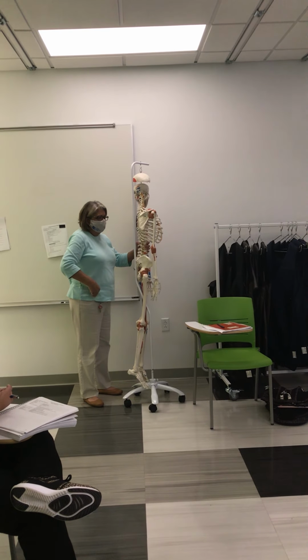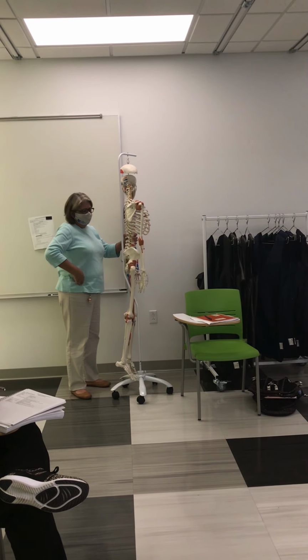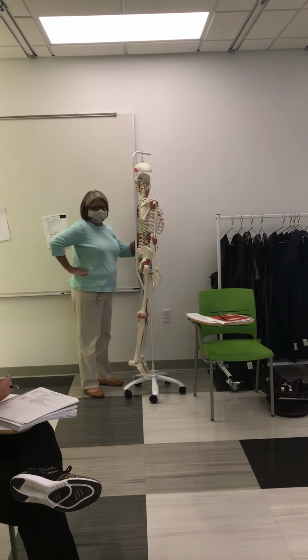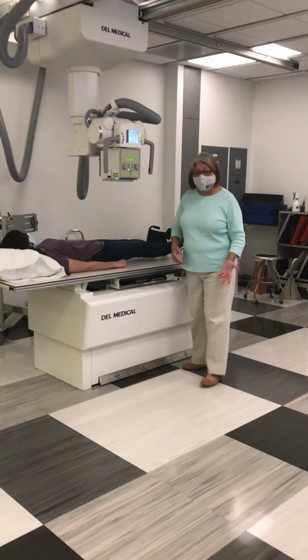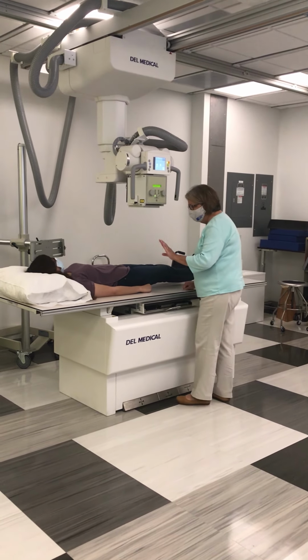We need to palpate the iliac crest and appreciate that that is lateral. If you're palpating anteriorly and more medially, you're likely to end up centering too low. So you have to palpate for the iliac crest laterally. And this takes practice. You always want to tell your patient what you're going to do before you touch them. Ma'am, I'm just going to feel for a spot on your hip.